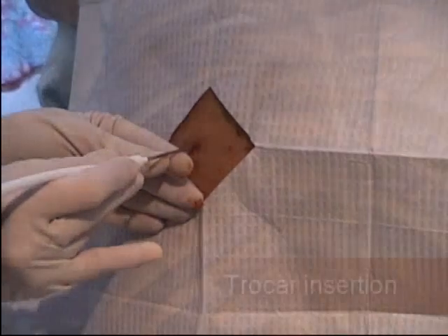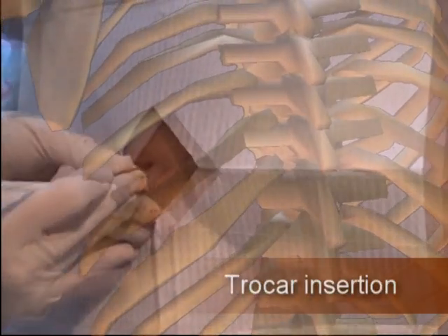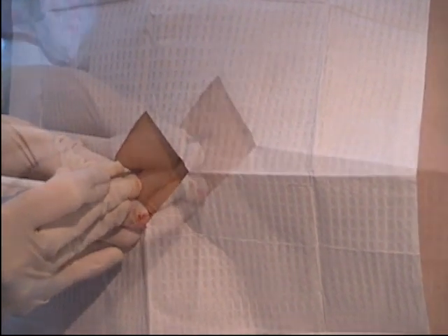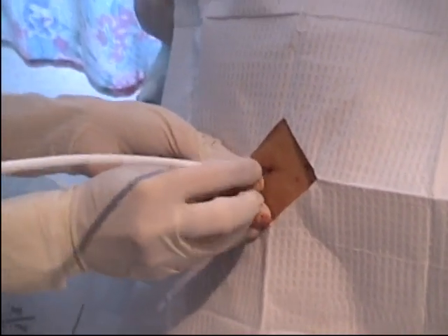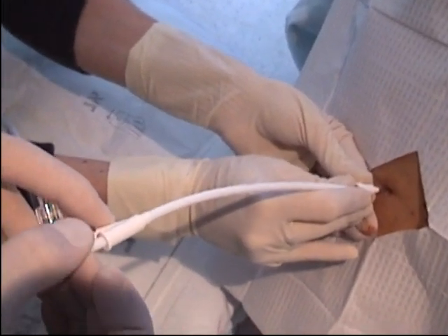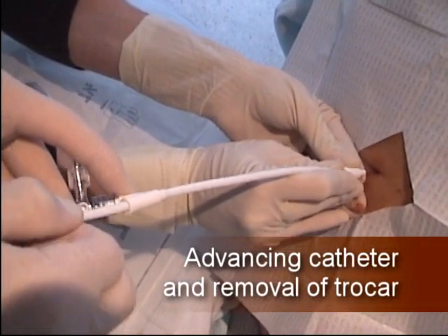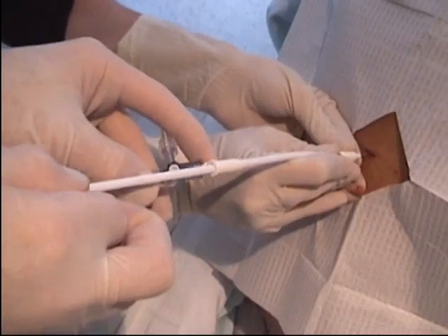Carefully insert the trocar just above the rib where the anesthesia has been placed. Apply negative pressure to the syringe so that it is obvious when the pleural space is entered. Advance the catheter and then withdraw the trocar, leaving the catheter in the pleural space to collect fluid. The catheter is never withdrawn through the trocar as long as either device is in the patient.